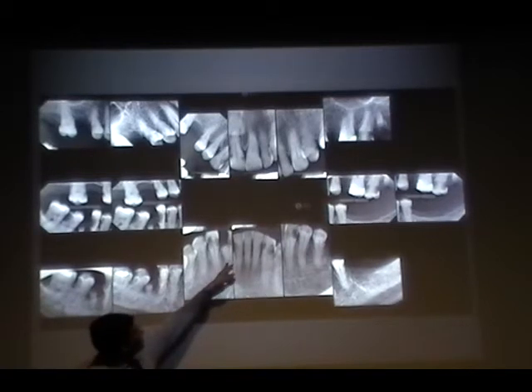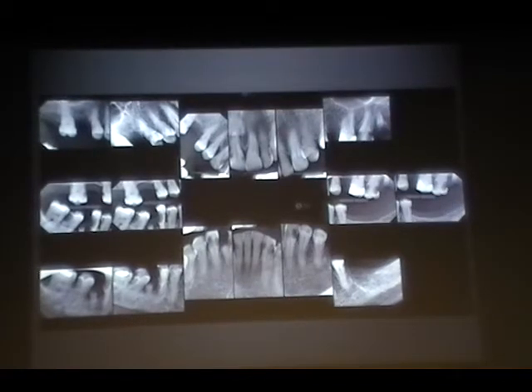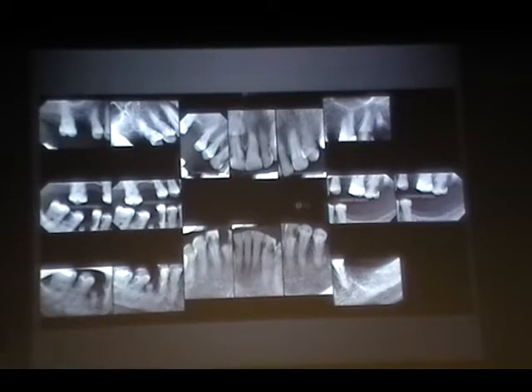So this is lateral, right? Canine, yes. So there is the open contact between the lateral and the canine. Yes. So I think this is okay. So basically the sensor is flipping. But this view, the occlusal on the crown of the canine, the first premolar is missing, and also it seems like it's tilted or might be malocclusion in the second premolar region.